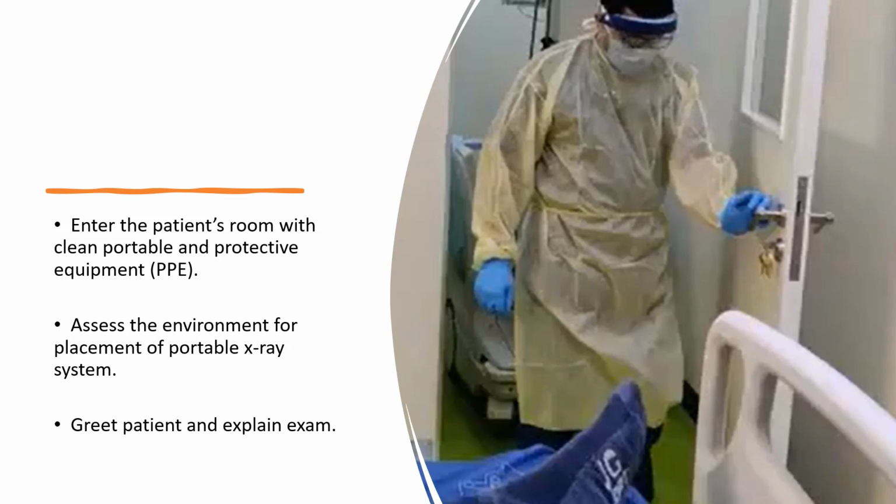I used to hate the idea of people walking in to do a portable examination, not really interacting with the patient, going ahead and sliding a cassette or imaging receptor behind the patient, throwing on a lead vest, making sure everybody was out of the way, getting at least 6 foot away or outside the door, and then yelling at the top of their lungs, "X-ray!" just so other people wouldn't get any ionizing radiation, and then leaving. The patient, meanwhile, has no idea what was going on and thinks that, boy, that ionizing radiation must really be dangerous because they're scurrying out the door, yelling X-ray, and getting everybody out of the room.